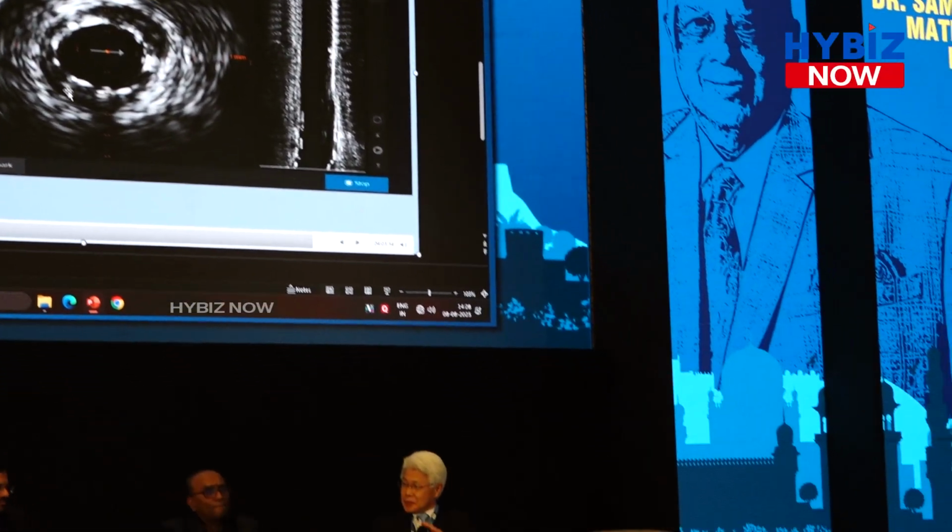For the distal edge, you are showing only stent. Compared with DCB, I think the DES should be better in the report. But now we try to do the DCB in these cases. We want to have the data.